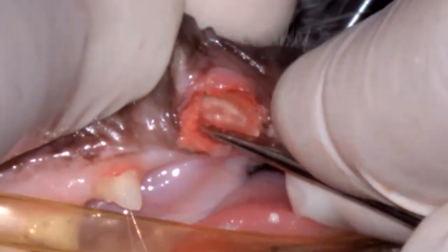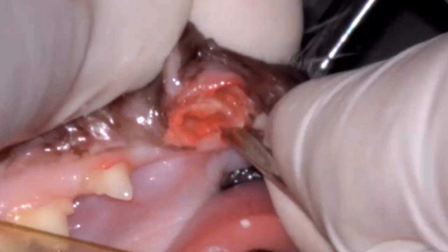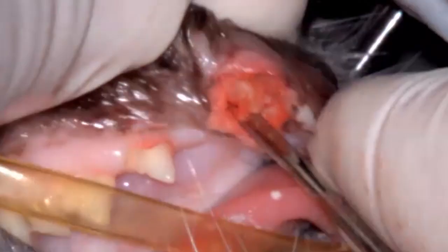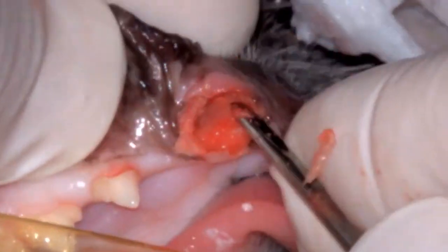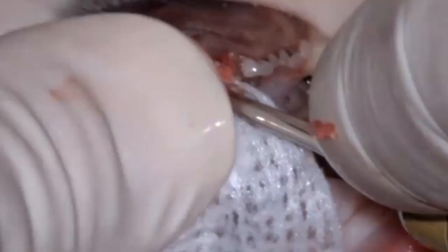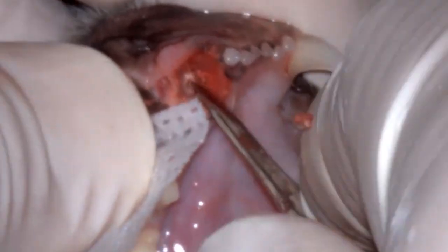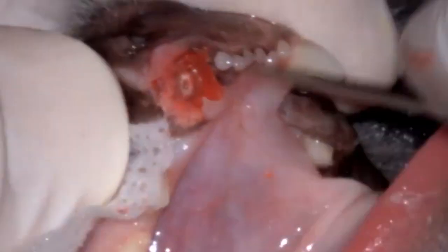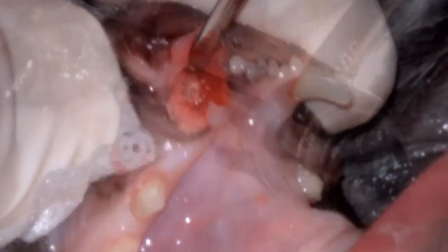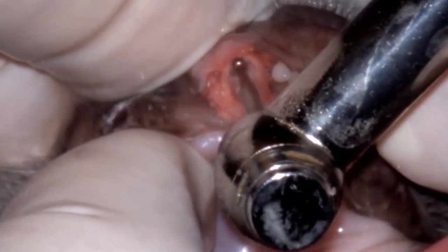The root separation was rather oblique — there's more of the lingual surface still in the socket. I'm able to elevate out that chunk, though it went flying off. Now we have the apical third of the root still in place. To visualize the separation between root and bone more clearly and see the interface so I can continue to moat around it, I'm going to use a burr to smooth down the root and bone — not trying to drill the root away, just creating a smoother surface that makes it more visually apparent what is root and what is bone.